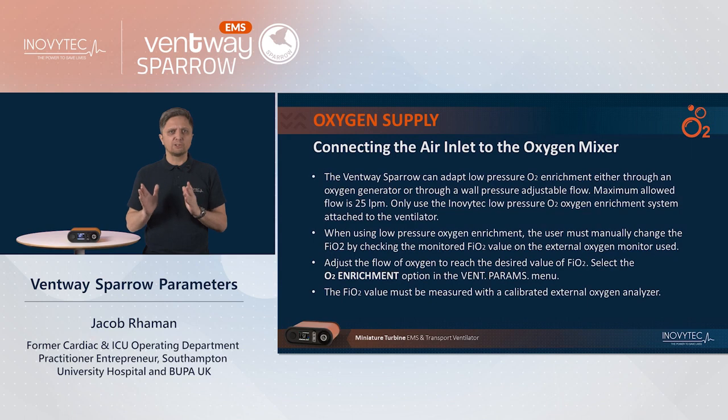The oxygen enrichment device is fitted to the input of the ventilator and fully extended. It delivers low flow and with as little as 1 to 2 litres per minute, with the inspired oxygen concentration reaching as high as 50%. This makes for a very low consumption of oxygen and is ideal for lengthy patient transfers.